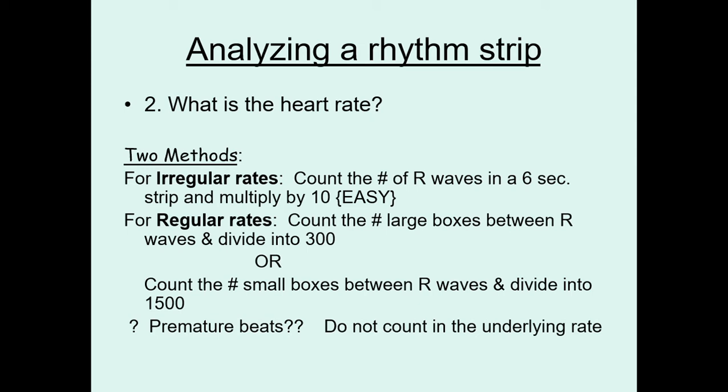Now, one thing that I want to caution everybody about is just because you have EKG complexes, that does not necessarily mean that you've got a heartbeat, because you have to remember the EKG represents electrical activity, and there should be a mechanical response that follows. There are situations where a mechanical response does not follow. This is why you have to assess the patient, not the monitor. If a patient has an EKG rhythm, you can look and see what the rate is on the rhythm, but to know that the patient has a heartbeat, you have to assess a pulse.